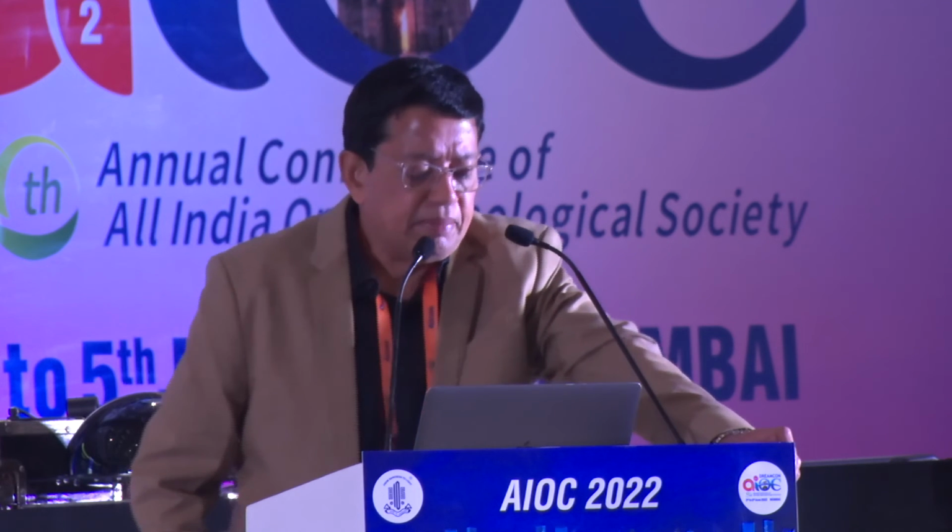As far as astigmatism is concerned, I already mentioned this in an earlier talk of mine. That is extremely important, especially when you talk about multifocal lenses, that unless you correct the astigmatism adequately, it's not going to be a happy patient. And posterior corneal astigmatism, surgically induced astigmatism, and toricity ratio are things that we need to understand quite completely.